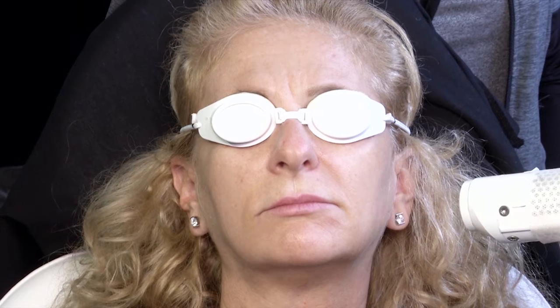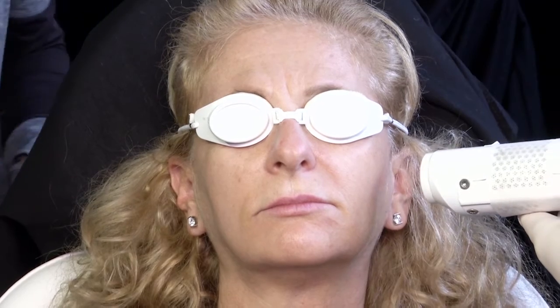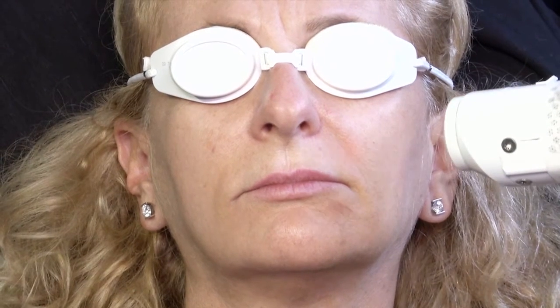I tend to cover the whole area, usually twice. This is a completely comfortable treatment. She's had no topical anesthetic, no local anesthetic. I think it's fair to say she's pretty comfortable. If she has some dark-haired areas, that will help those as well. And then once I get done with all of this, we're going to go back and treat a telangiectasia on her nose and a solar lentigo on her forehead.